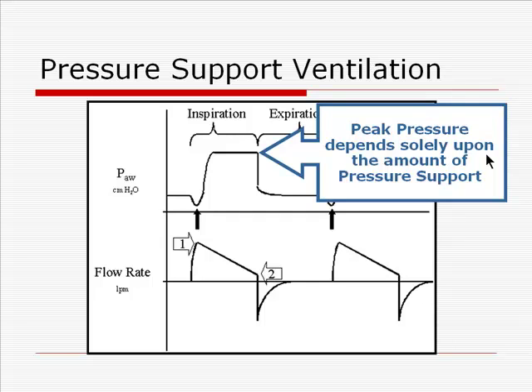The peak pressure is set by the physician, in that the maximum pressure the ventilator will ever deliver is the sum of whatever PEEP the patient is receiving with whatever inspiratory pressure level has been set by the physician. Hence, with the peak pressure determined by the physician, theoretically the risk of barotrauma might be reduced.